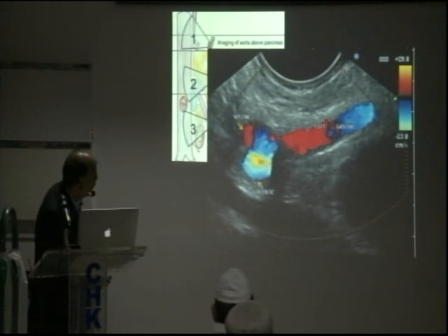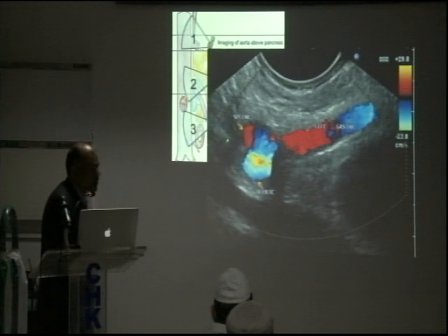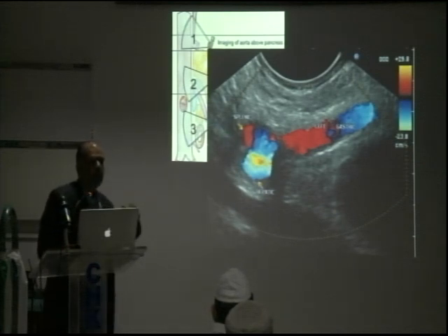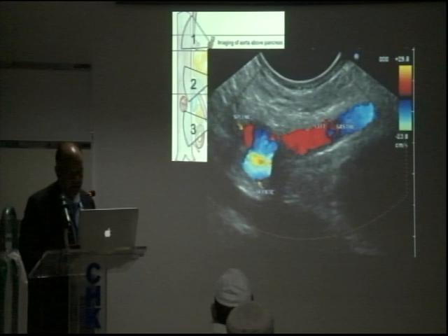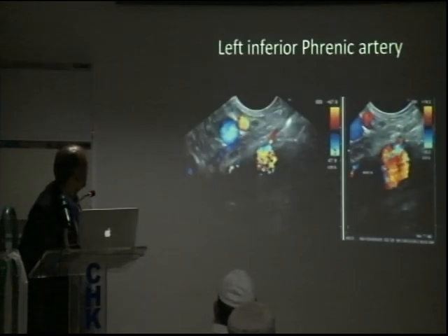So the one which goes above, once you have the celiac dividing into 3, hepatic goes down, left gastric goes this way, splenic this way, and now you follow this splenic to go to the pancreas. So if you follow the structures, if you remember my first slide, you will end up on the desired place where you want to be. Okay. So just forget about that.